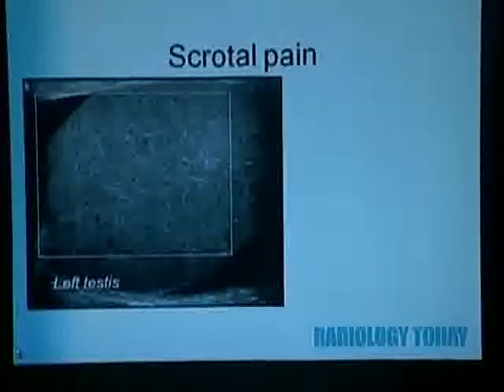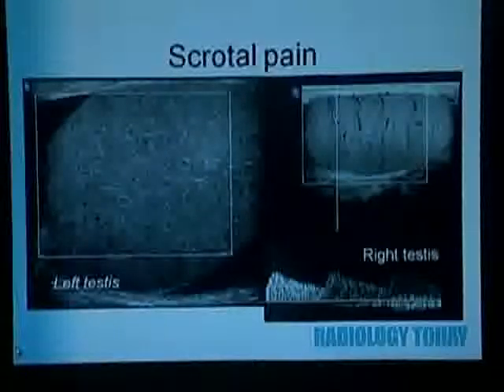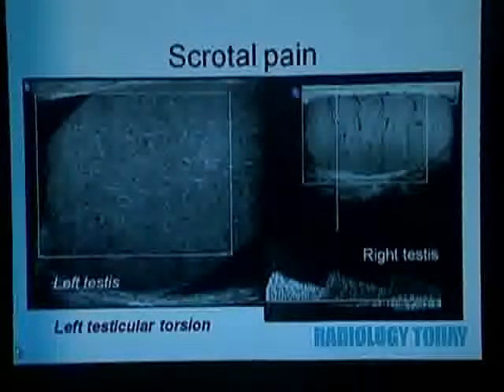Now, in the male with scrotal pain, ultrasound is your modality. And with acute pain, this time left-sided, the color Doppler images showed no flow in the left testis. Right testis showed flow with a normal waveform. This is left testicular torsion.